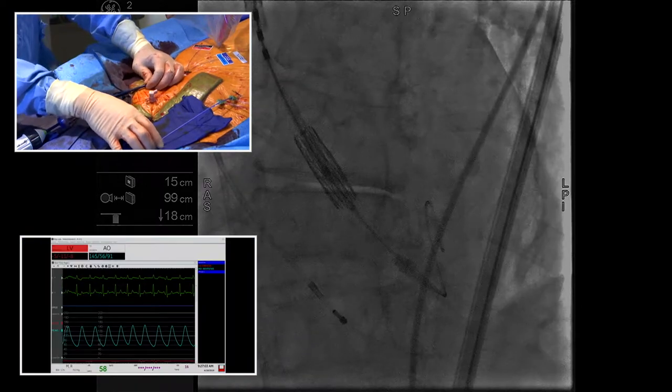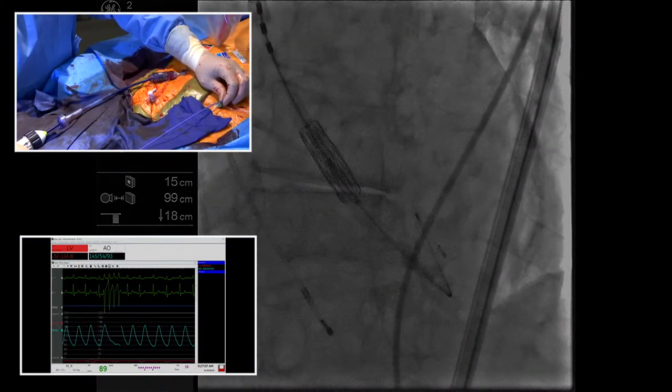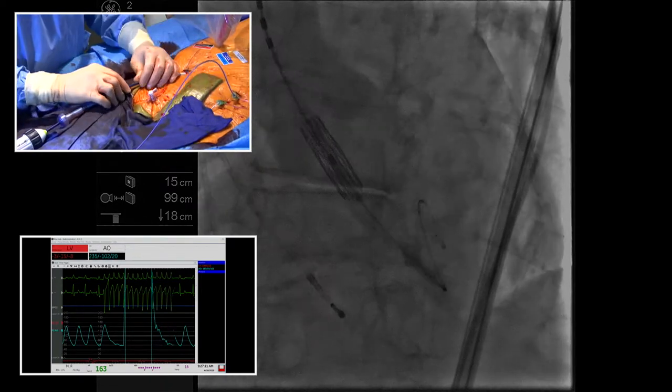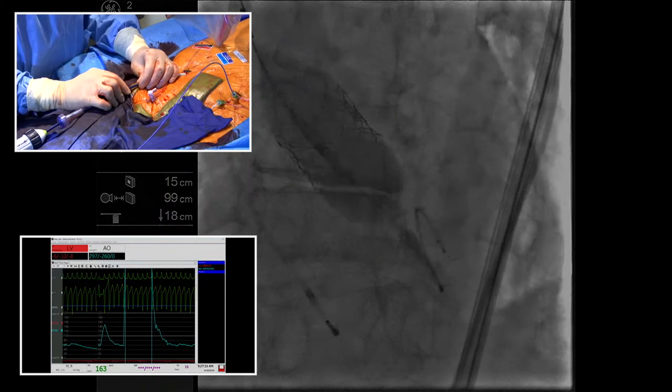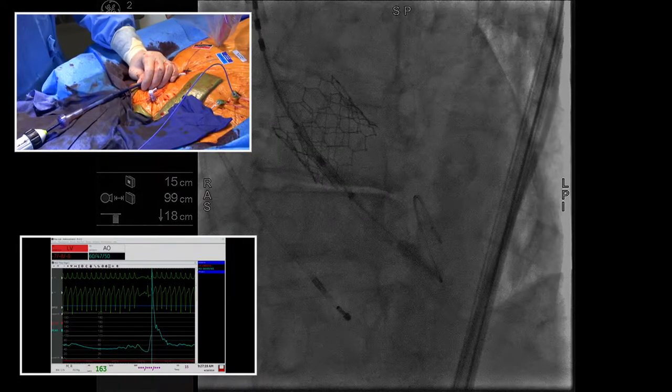All right, pacer on. I think it's good. Deploy. Good. Keep pacing. Keep pacing. Pacer off. Store the fluoro. Well done.